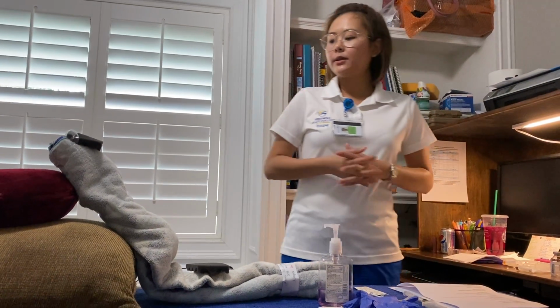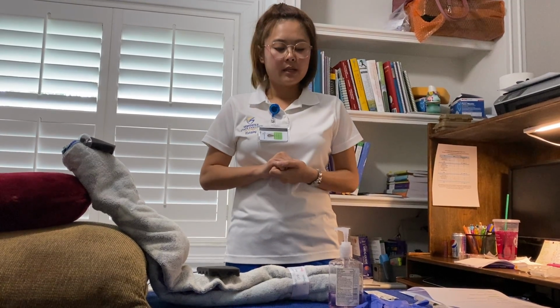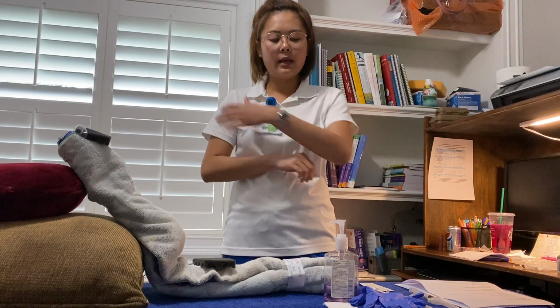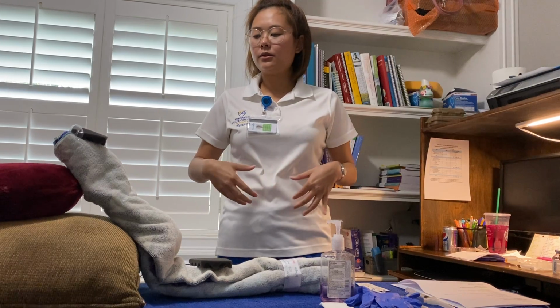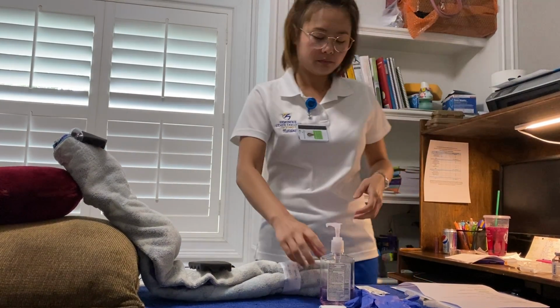Today I'm going to give you medication. I have 2 injections to be given to you. One is going to be a flu shot. It's going to go on your upper arm right here, and another one is going to be your B12 for your anemia. It's going to go into your abdomen. Do you have any questions? No? Okay.